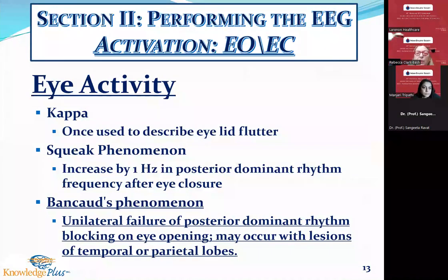Kappa used to be a word we used to describe eyelid flutter. Now they just call it eyelid flutter. Squeak phenomena: when the patient has their eyes open, their PDR, their posterior dominant rhythm, decreases by about 1 to 2 hertz. When they close their eyes, which is called squeak, it then increases by that 1 hertz. Bancaud's phenomenon is when you have unilateral failure of PDR on eye opening, and that may occur with lesions of the temporal or parietal lobes. However, again, when it is the only finding, it is not considered significant.